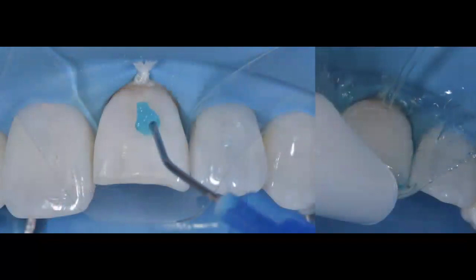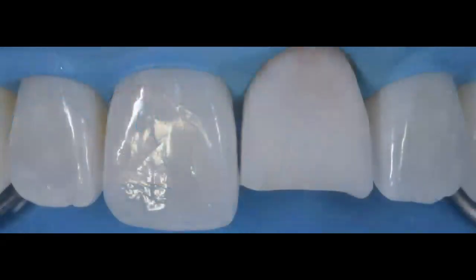So now I'm just going to go directly and etch this enamel. And because this enamel was not cut with a bur, I'm going to increase the etching time. So I'm going to etch for 30 seconds instead of 15 seconds. I have a very high fluoroapatite type of enamel that is more acid resistant. So that's the reason why I'm increasing the etching time. I'm going to then rinse after those 30 seconds, dry the tooth, and you can see I bone dry the tooth. Very nicely etched enamel all around. Really, really good substrate. Very, very easy to bond to and a very predictable bond for this substrate.